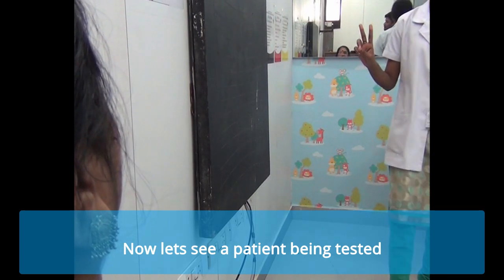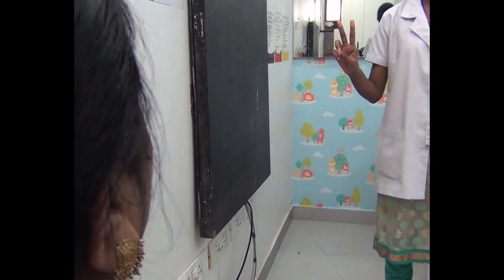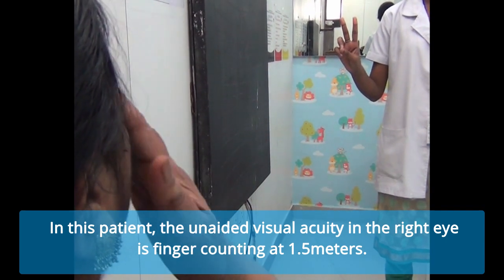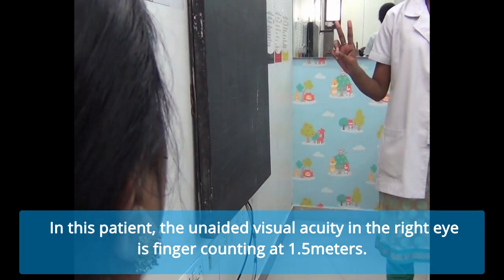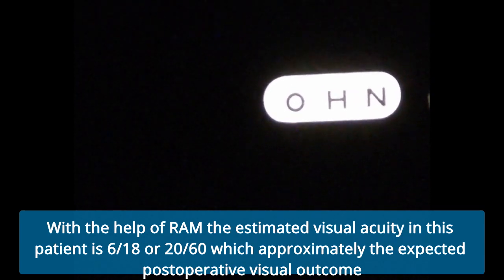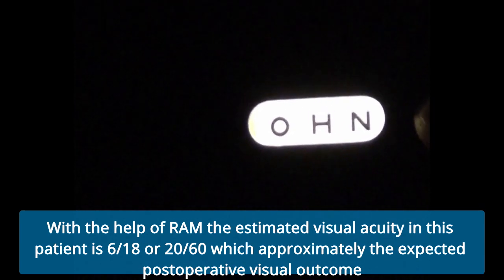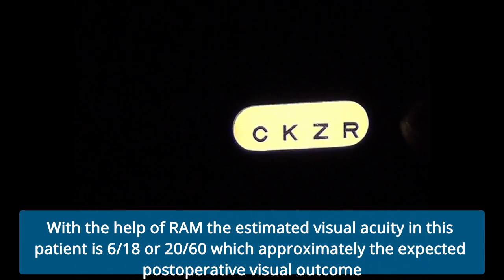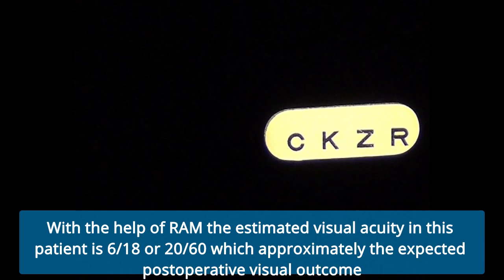Now let's see a patient being tested. In this patient, the unaided visual acuity in the right eye is finger counting at 1.5 meters. With the help of RAM, the estimated visual acuity in this patient is 6/18 or 20/60, which is approximately the expected post-operative visual outcome.